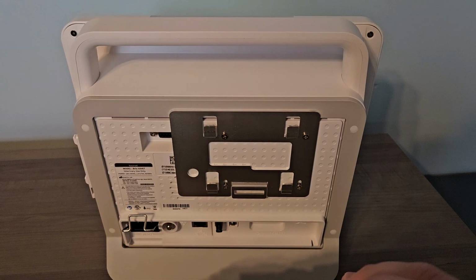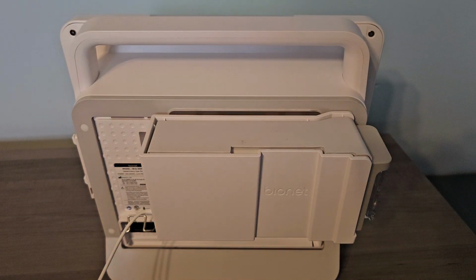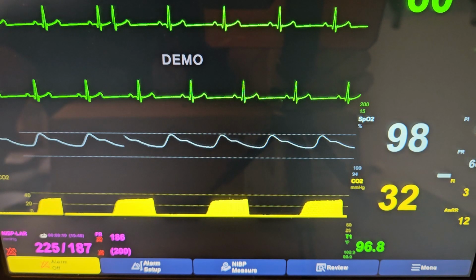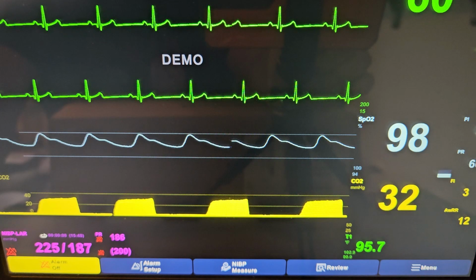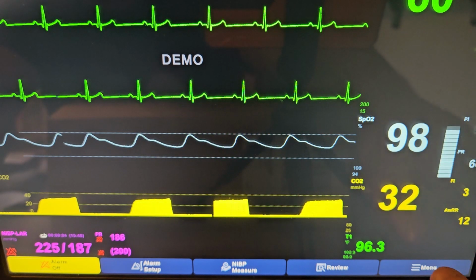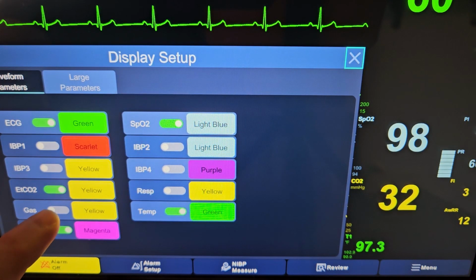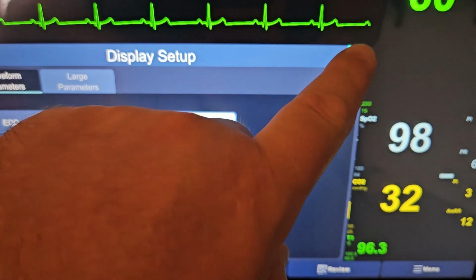To mount the sensor, slide it onto the mounting plate on the back of the monitor. Plug the sensor cord into the yellow EtCO2 port on the side of the monitor. Before monitoring via the dual gas module, the gas parameter must be turned on within the monitor itself. Tap the menu button, then tap Display Setup, set the gas parameter to On, and exit the window to the main screen.